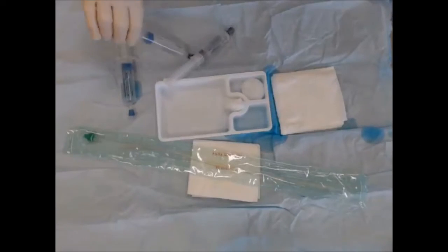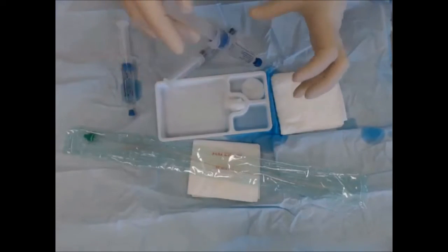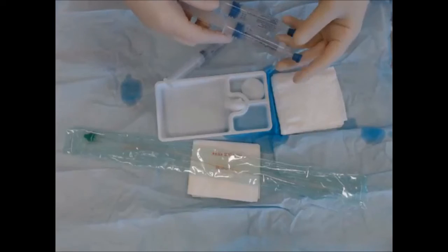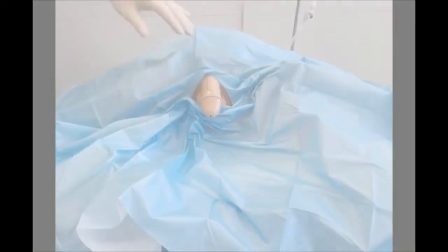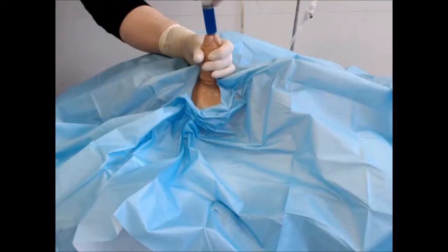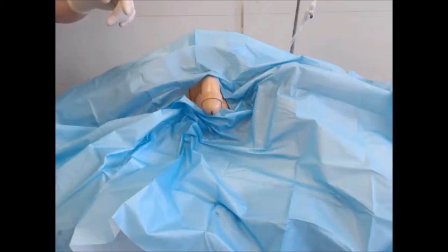First, use the Instilagel — 10 to 20ml is recommended. The most important thing is to put it in slowly with the penis at 90 degrees. When you inject this into the meatus, make sure it's not bubbling back at you — you want it to be going down. If it does start to bubble back, take a second syringe and inject that additional 10ml as well. The slower you do it, the more effective it will be. Hold the penis at 90 degrees, insert the Instilagel, which is both a lubricant and a local anesthetic, and inject it slowly. If you relax your hand so you're not obstructing the gel, it works better. It takes one to two minutes to work, so after injecting 10 or 20ml, give the patient a few minutes for the lignocaine to take effect.